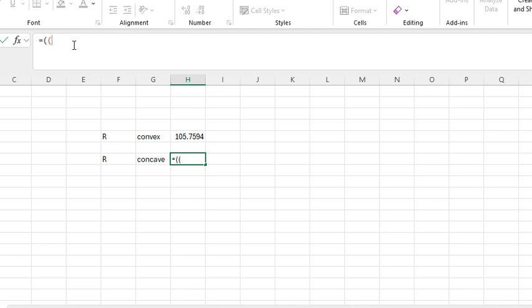So I think it was negative 1.6, and then you've got to divide that by 2. And then you're going to have 71 to the power squared, divided by 8 times negative 1.6.